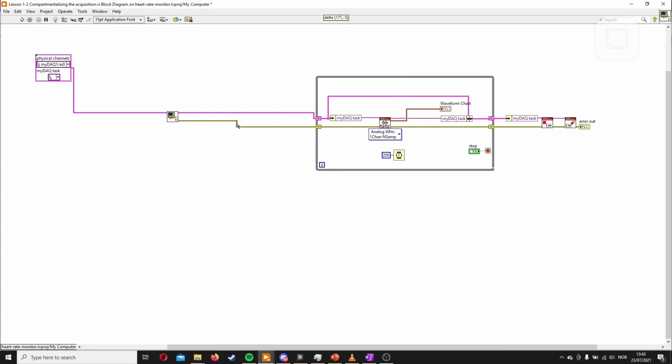That's our first sub-VI. And our next sub-VI, we want this task here to go in and out, but we want the waveform chart to be an output so we can read it from outside of the VI. And we don't want the loop to be inside the VI, because then it will be locked inside the VI. So what we want is just this simple read function to be in there, and then the while loop here can call it.